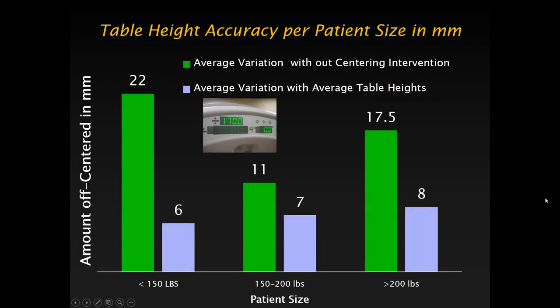Well, we found on average that when we tried to do this for small, medium, and large patients, we were off by 22 millimeters, 11 millimeters, and 18 millimeters. We also found that doing that on every patient was not a workable workflow. So we scratched our heads for a bit.